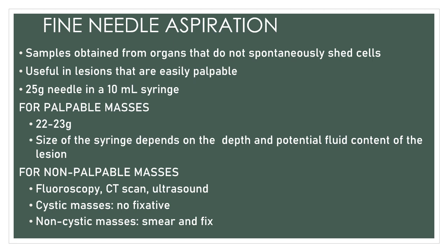The size of the syringe depends on the depth and potential fluid content of the lesion. If there is more fluid present, you use a greater volume.